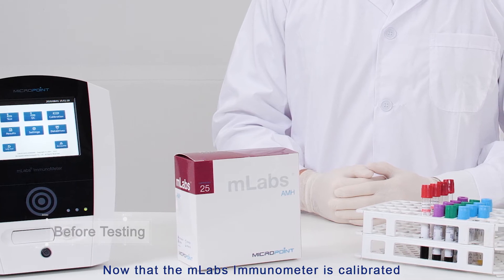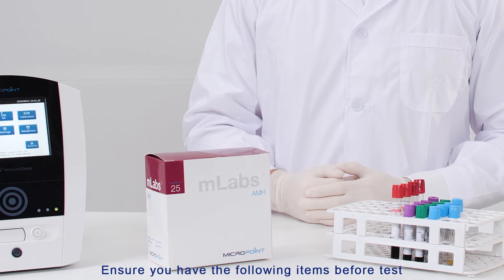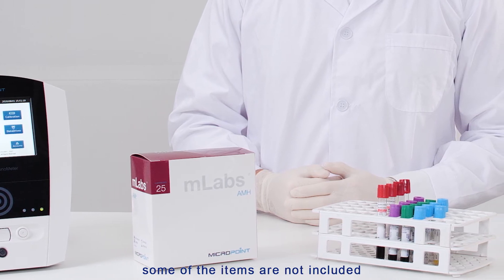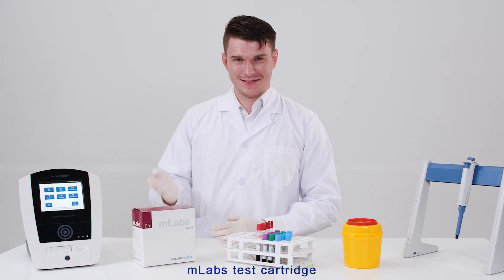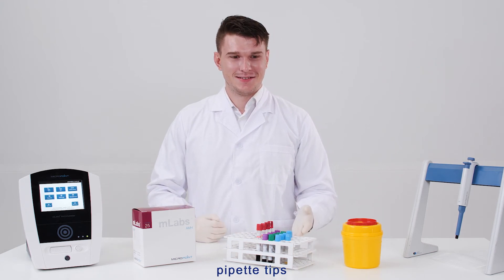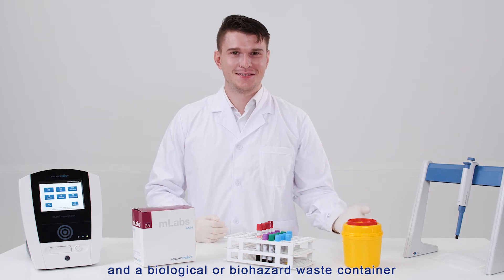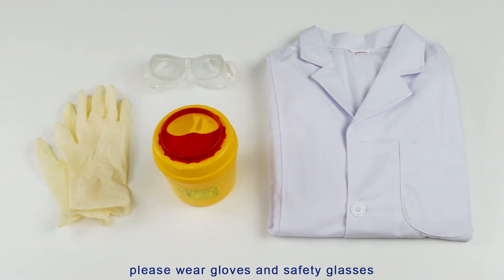Now that the M-Labs Immunometer is calibrated, ensure you have the following items before testing (some items are not included): M-Labs Immunometer, M-Labs test cartridge, the patient sample, pipette tips, a biohazard waste container, and a pipette. Please wear gloves and safety glasses as well as appropriate laboratory clothing. Discard used cartridges and pipette tips into the biohazard bin.